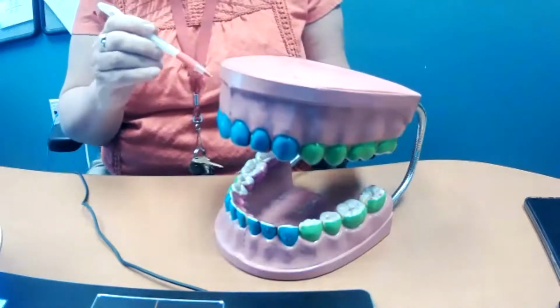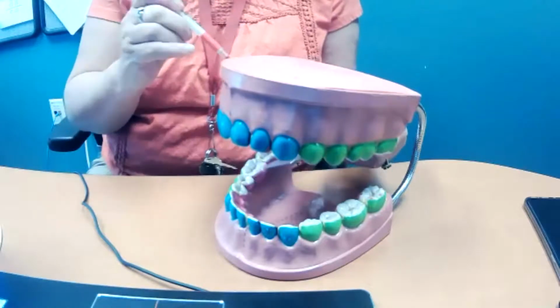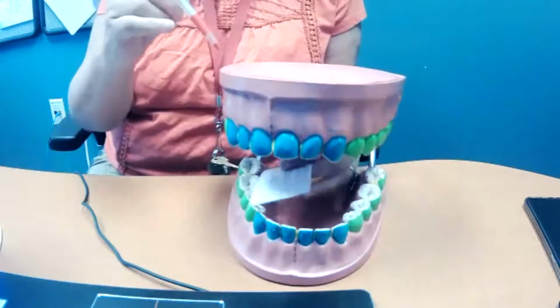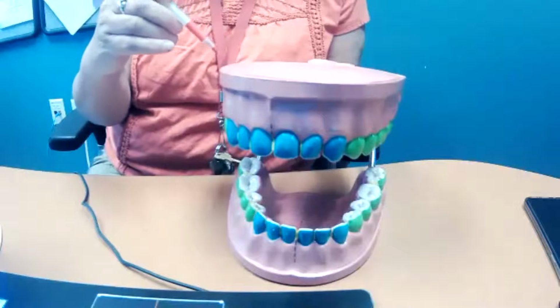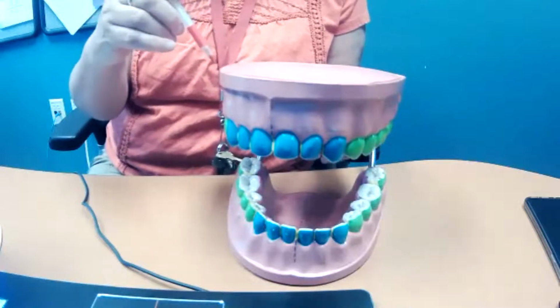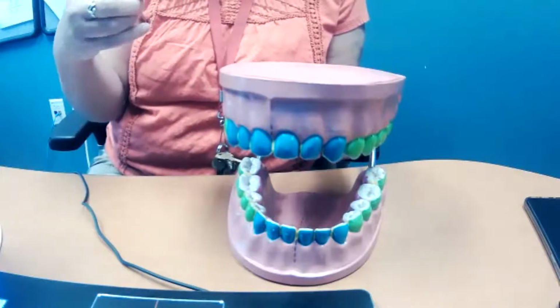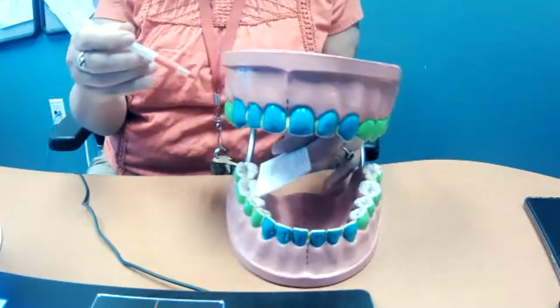So when we take an image on the maxillary, our PID needs to be plus, right? We have plus and we have minus. Plus when we move our PID tube head from the top, and minus is positioning from the bottom. So when we do plus positioning or plus angling, it's going to go from the top.